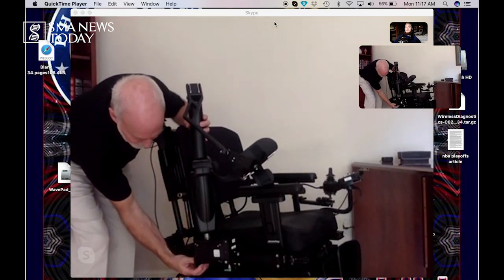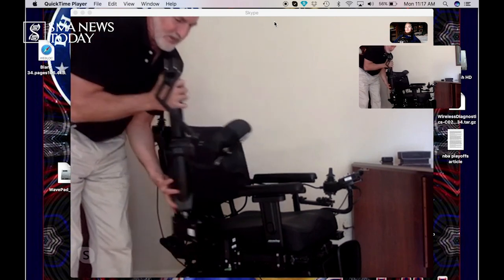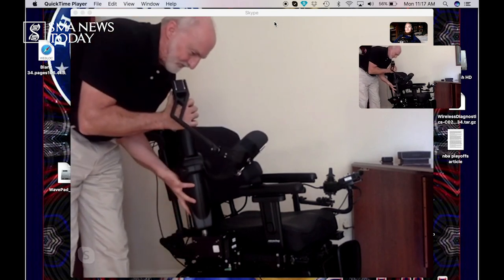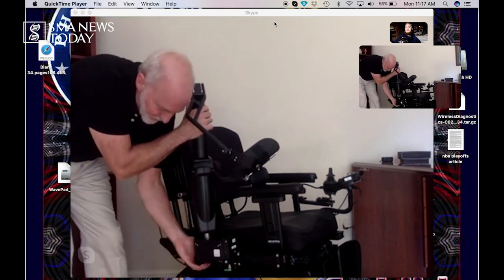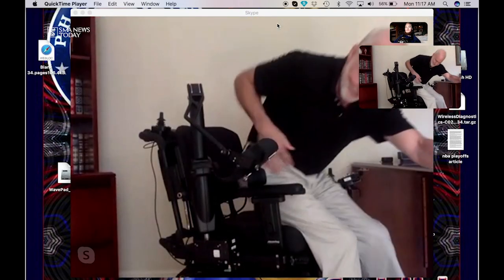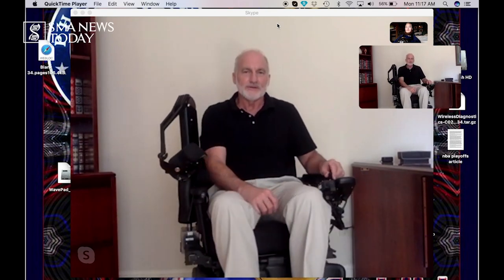To remove the device, the caretaker pushes the button on the back, releases it, and it lifts off — easy on, easy off. It weighs 15 pounds, so it's not super heavy, and the caretaker will be able to put it on and off very simply and easily. That's a quick demonstration of what the device does.